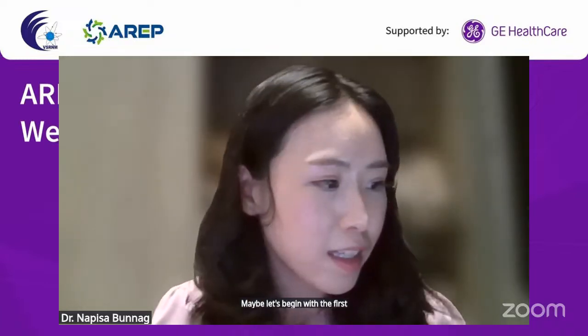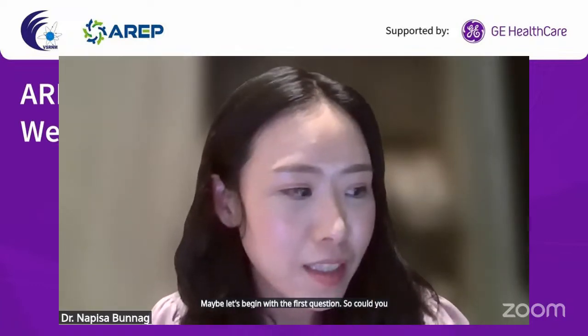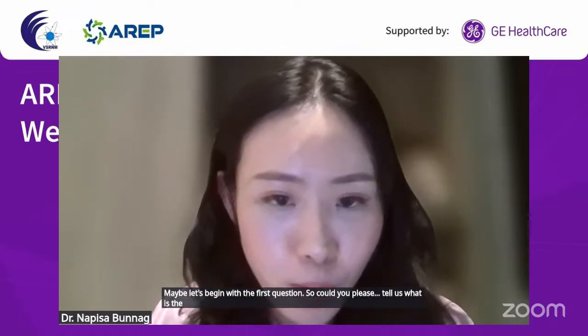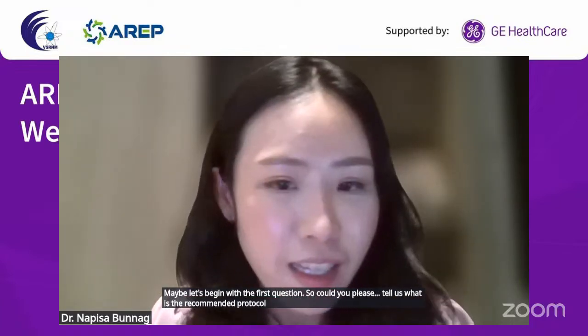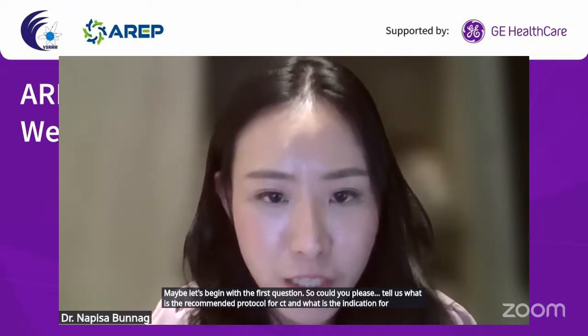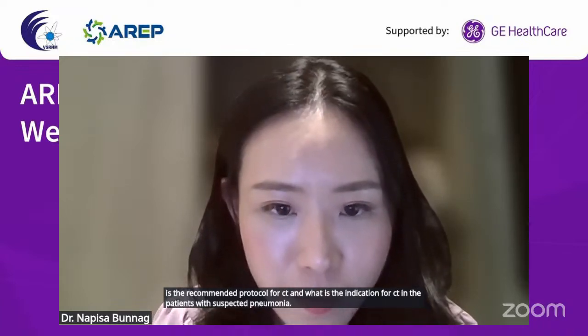Maybe let's begin with the first question. Could you please tell us what is the recommended protocol for CT and what is the indication for CT in patients with suspected pneumonia? I think that is a great question.